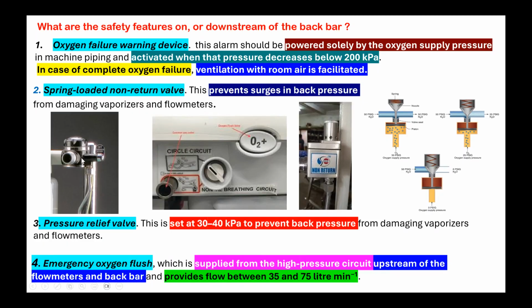The older Boyle's machine is pneumatically operated, with no electrical component. This part which you see as a flap, there it is written off position. If this knob is on the upper side, there is no oxygen flush working. When you turn this knob downward, it will activate the oxygen flush. So this is the apparatus and this is the circuit selector. This is the common gas outlet. And you can see there is a separate pipeline coming to supply oxygen for the oxygen flush. So this steel tube, are you all able to see that? Is my pointer going on that?